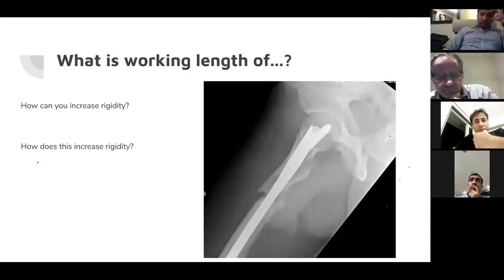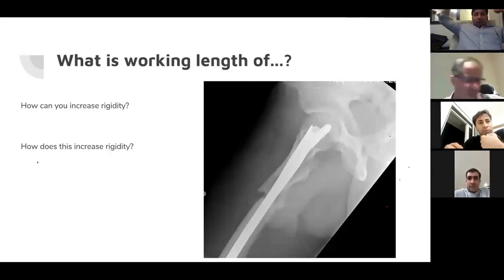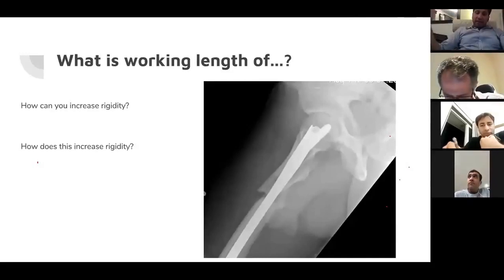What it does, first of all, yes, you're correct, is it becomes less rigid as a prosthesis. Titanium is less rigid as a prosthesis. It is more flexible and has more elastic properties compared to stainless steel. Titanium has the Young's modulus closer to the bone, and hence it prevents stress shielding.